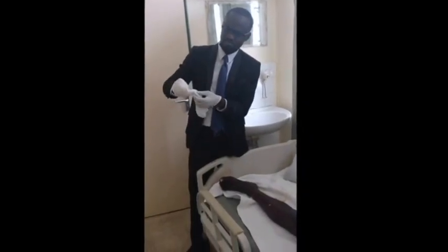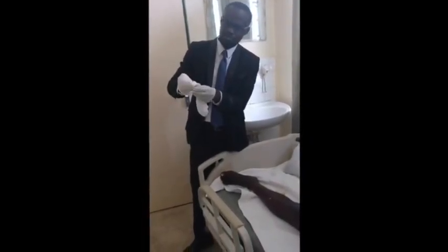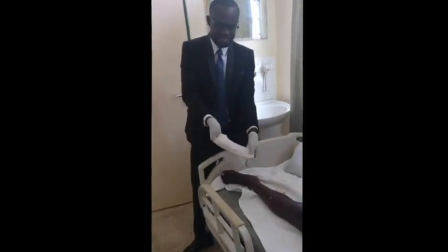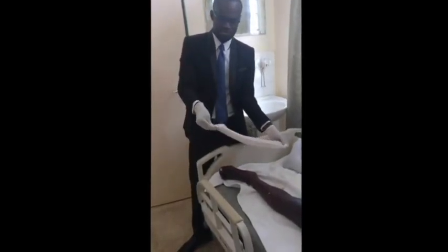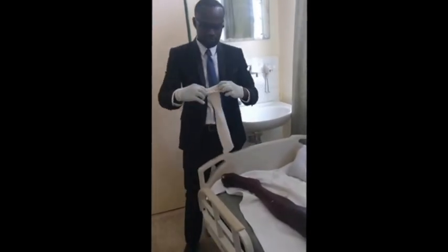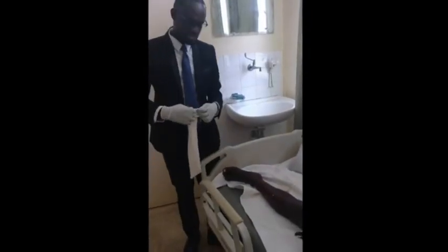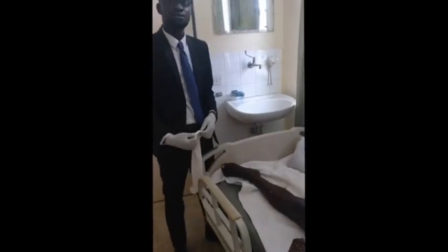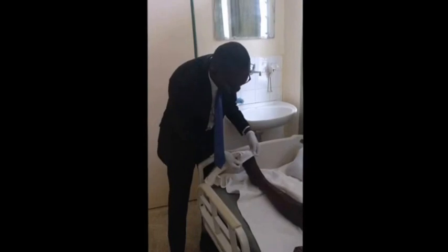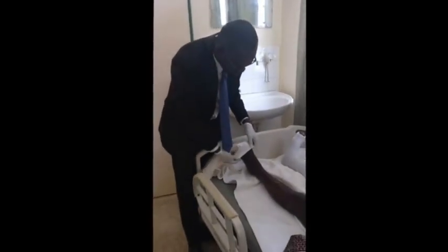And then grasp the center of the heel pockets like this. Once my hand is in, I turn it inside out. So I have something like this. Then once I turn it inside out, I'll put the stocking over the foot, in this way.